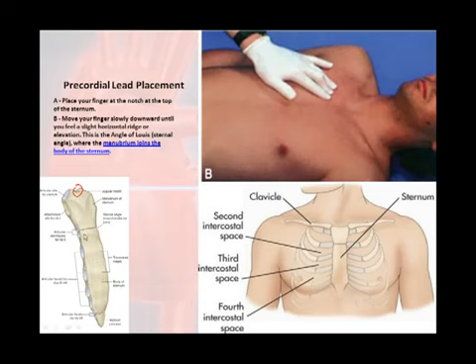So you're looking for this little spot right here, that landmark, which in this case is called the manubriosternal joint. It's also sometimes called the angle of Louis. Once you find this spot right here, this is your second landmark. You're going to start here and migrate your fingers down until you feel that joint right there.